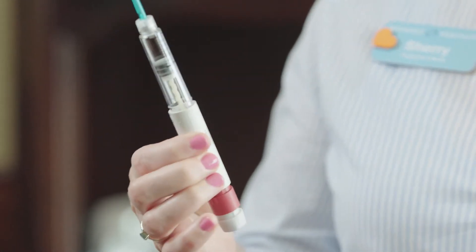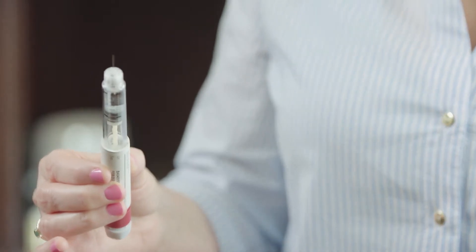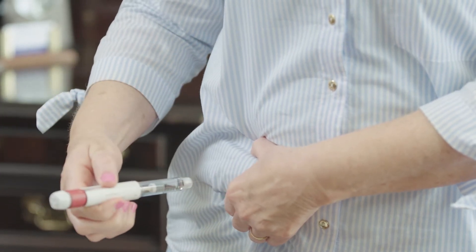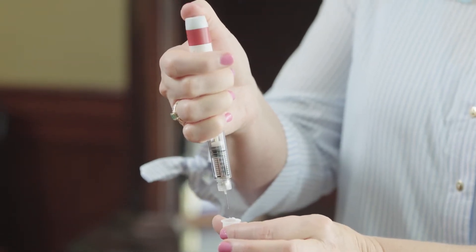Because you have your dose dialed into the pen, there is no need to prime your needle — it is ready to give the injection. You will pull the small sheath off the pen needle and discard it into your biohazard. Then take your pen, pointing the window up, and pinch the tissue. The needle does have to go all the way into the hub, straight in or at an angle. Once the needle is fully into the hub, push on the base of the pen and continue pushing until the red is flush with the white on the pen, and your window reads zero.